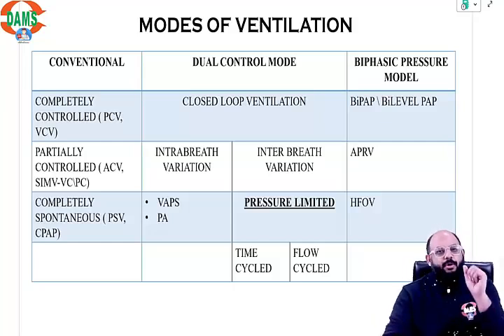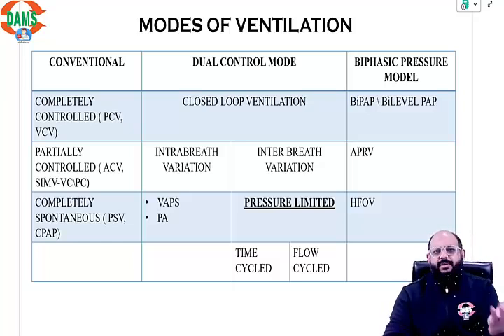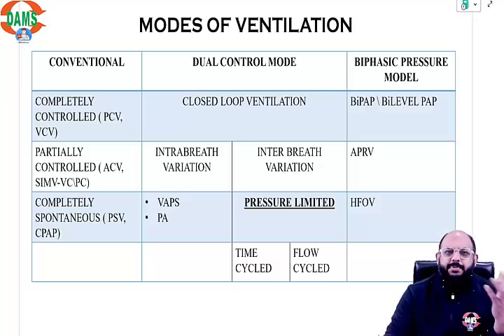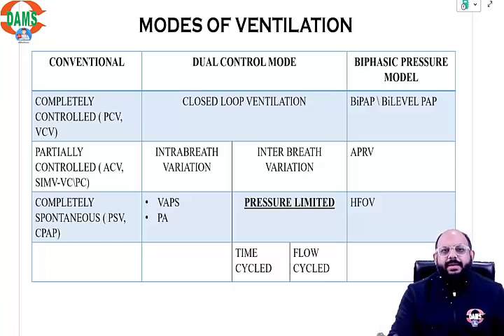The problem that happens when we are discussing a topic like newer modes of ventilation is that we don't use it. And because we don't use it, our perception of things is not very coherent when we are writing. But if I tell you volume control ventilation, you will be able to write from whatever you do every day. You'll set a tidal volume, a peak inspiratory pressure, you'll look at the PEEP, the inspiratory expiratory ratio and stuff like that. So even if you have not read it properly, in a conventional mode of ventilation, because you use that mode, you will be able to at least write down something about it.